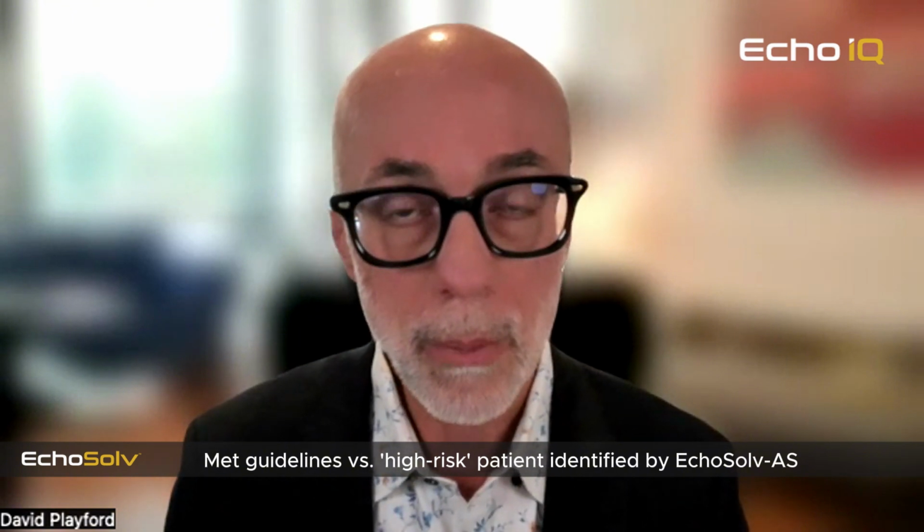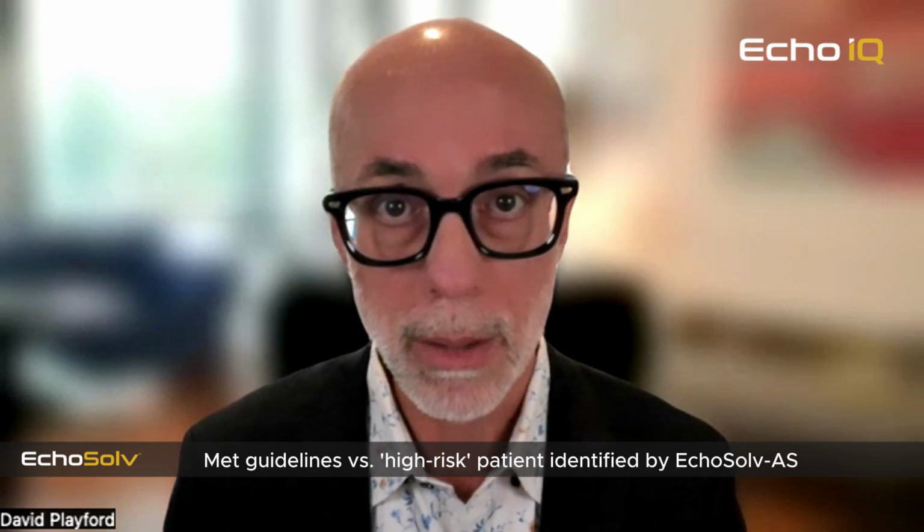So the high risk or high probability phenotype is a little different from severe aortic stenosis that's used in the traditional clinical practice guidelines, but does include the guidelines. So those patients who are high risk can be in either of two groups. They can either be high probability, high risk inside of clinical practice guidelines, or high risk, high probability, and outside of clinical practice guidelines. Those who are outside clinical practice guidelines are still high risk and still need to be further evaluated and monitored, but they haven't yet met clinical practice guidelines.